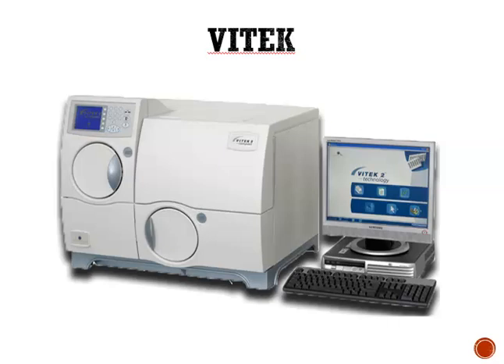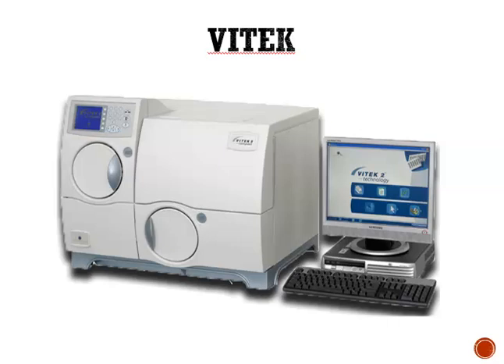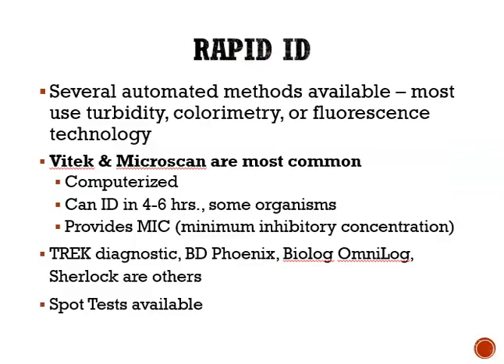Vitek is another. Whereas MicroScan is considered an open system because there's nothing that contains the reagents and the inoculum in that panel, Vitek, and I don't have a picture of it here, is like the size of a credit card, and everything is contained inside of that card. Some of these systems can give you an identification in 4 to 6 hours, which for microbiology is pretty fast.